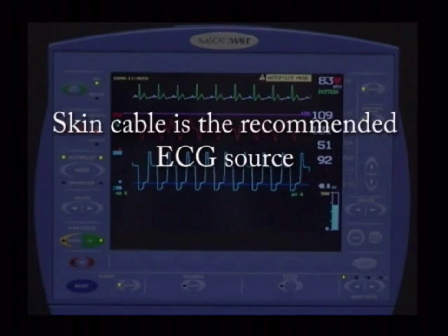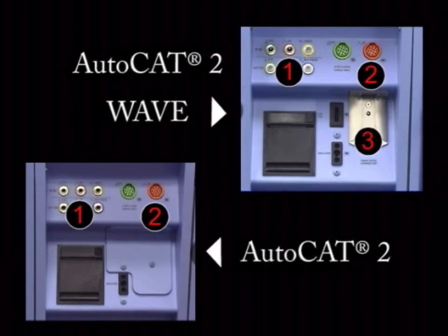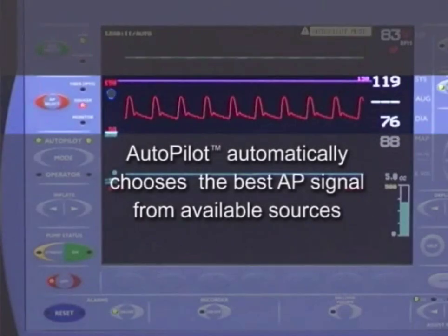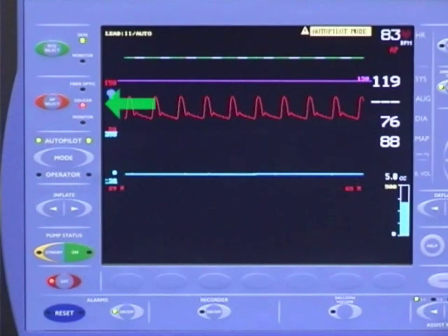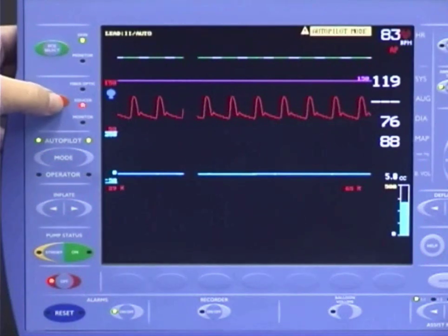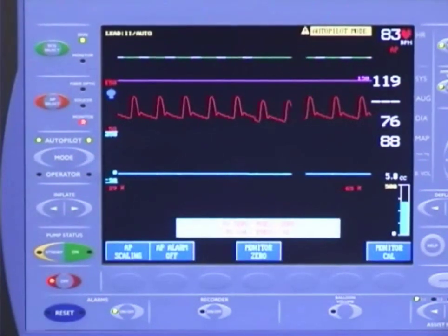When multiple ECG sources are connected, ECG skin and lead 2 will be the default setting if stable. You have three options in connecting an arterial pressure signal to the pump on the AutoCAT-2 Wave, and two on the AutoCAT-2. AutoPilot will automatically choose the AP source from those available. Even in AutoPilot, you may change the AP source if desired. However, if the light wave signal is available, the pump will automatically select it, even if you have changed the AP source. The AP select key is used to perform this function. The illuminated LED next to the key indicates the currently selected arterial pressure source. Pressing the AP select key twice will select the next source.